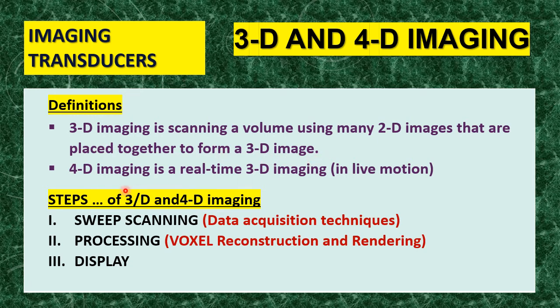Okay. What is 4D? 4D is real-time 3D. The process here is repeated many times while you are scanning. So this is like a live 3D. So 4D is real-time or live 3D imaging.